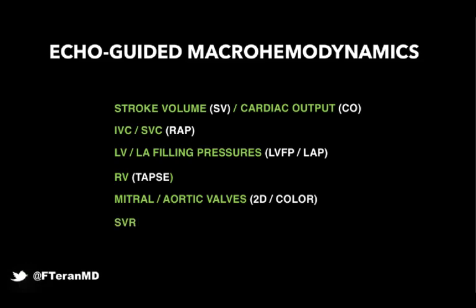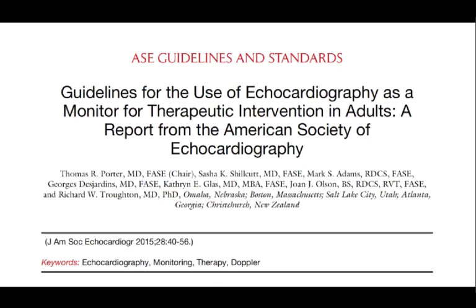valves. If you're wondering whether there's actual data for this, there's plenty of data, and in 2015 the American Society of Echocardiography published guidelines guiding the use of point-of-care echo for hemodynamic monitoring. If you're interested, you should read these guidelines. There are all sorts of standard values, how-tos, and competency requirements.